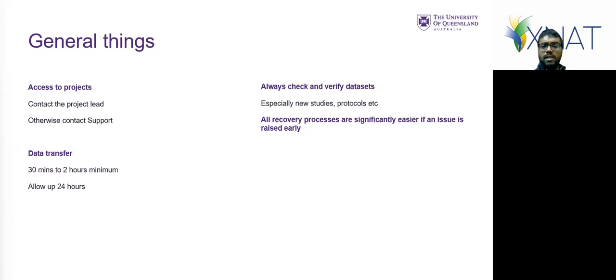I'll just address one of these questions. I think someone asked whether something's typed in by the radiographer. Yes, the project name and the subject ID are typed in by the radiographer or operator. So they'll be managing that. That is actually the only way we can tell what project or subject it is, because once it leaves the scanner, there's no way we can identify it. The radiographer does get that information in the referral, so it's whatever you said the subject ID is, whatever your code is.